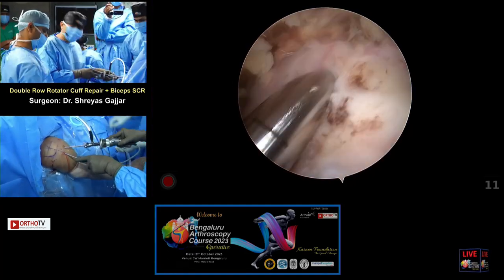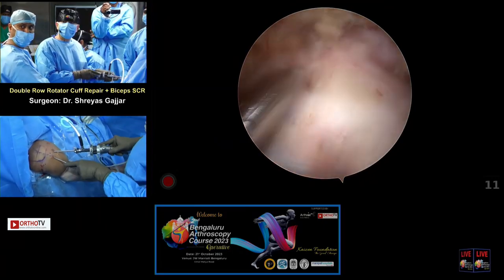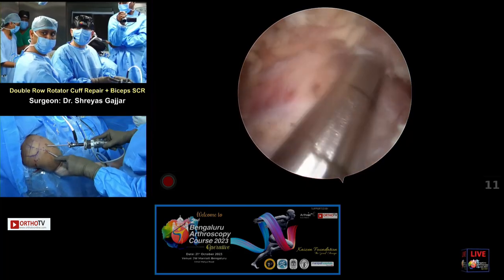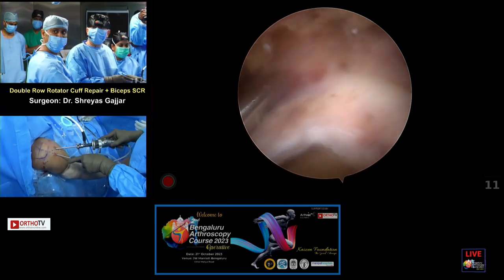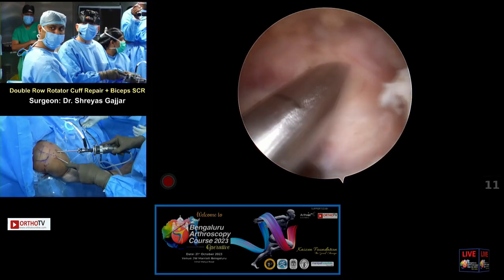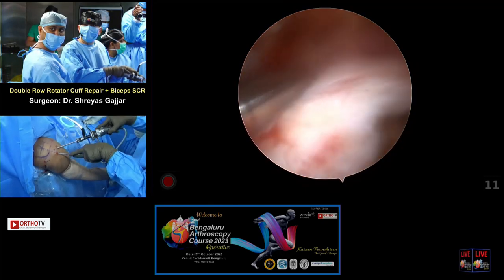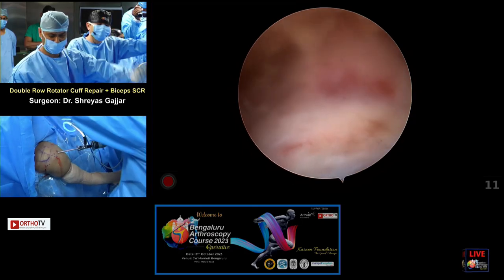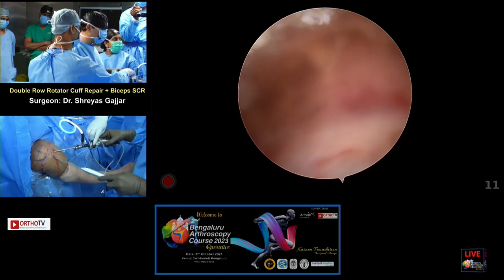So one tip is that while you are preparing the cuff area, don't use the cannula. I mean, you may not use the cannula throughout your procedure, but just for suture management, I tend to use it. But if you put the cannula beforehand, it restricts the mobility of the instruments, medial laterally or anterior posteriorly. So try not to use the cannula, just use your portal to prepare the cuff tear. And once you're ready to start your suture passage and tying or fixation, then you can use a cannula.